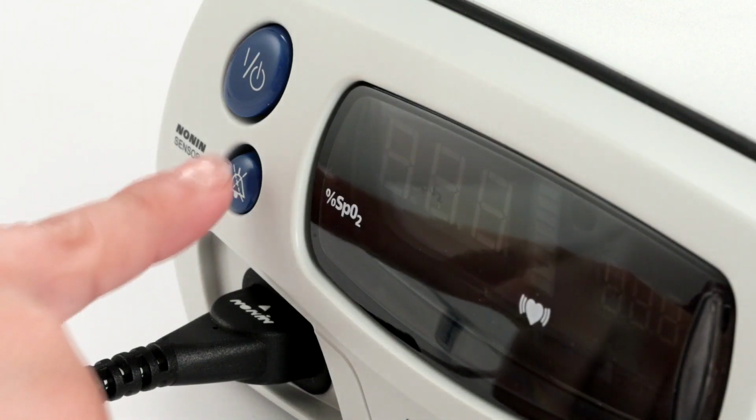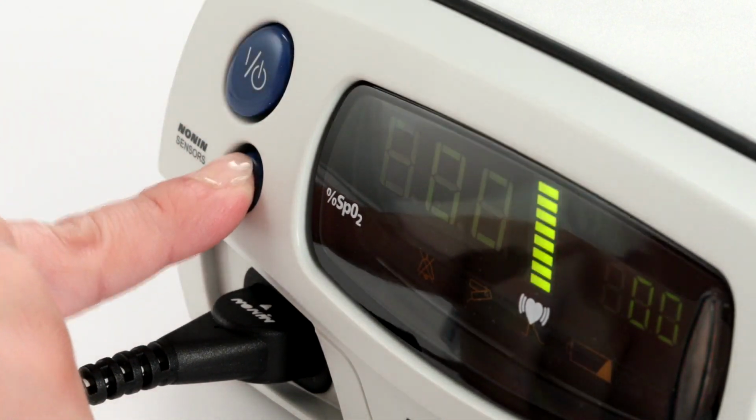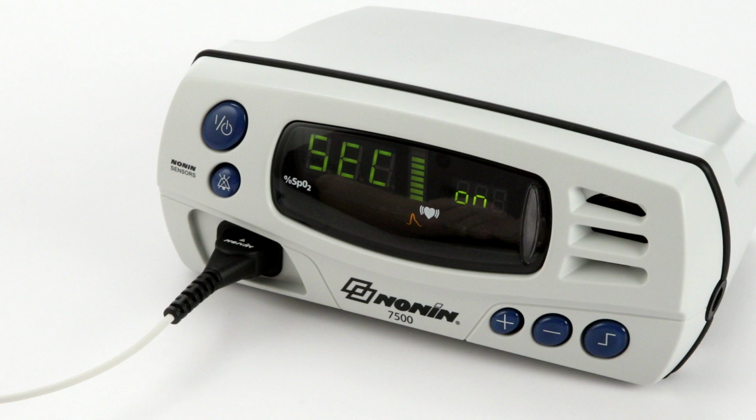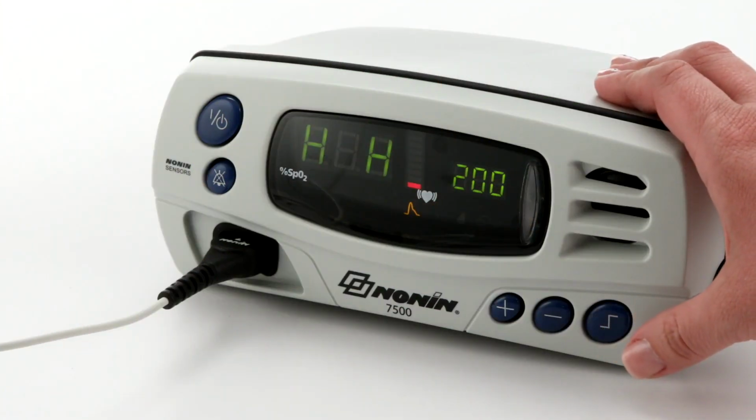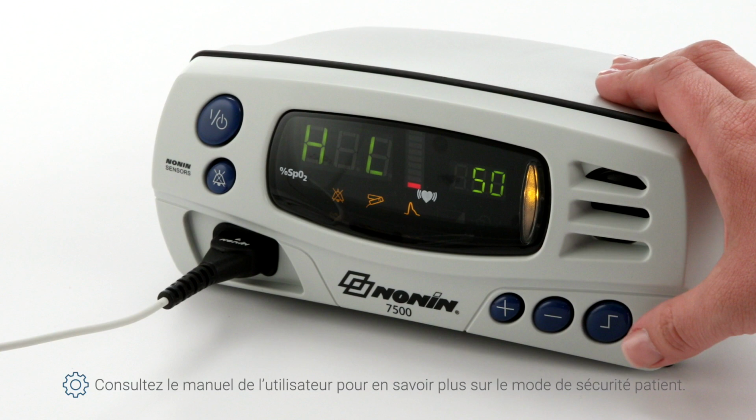A patient security mode may be set to prevent changes to alarm limits and other functional settings. When the Model 7500 is turned on in patient security mode, SEC on is displayed in the display area and 3 informational tones sound. The upper alarm limits are then displayed, followed by the lower alarm limits. Refer to the operator's manual to learn how to set or cancel patient security mode or reprogram settings.